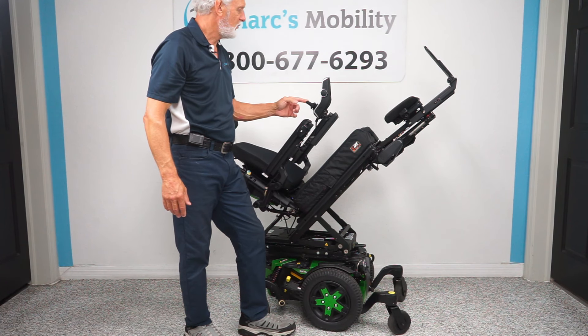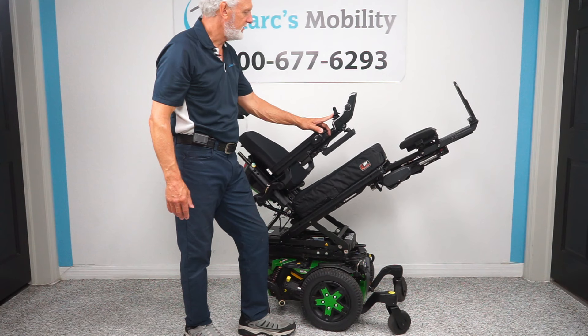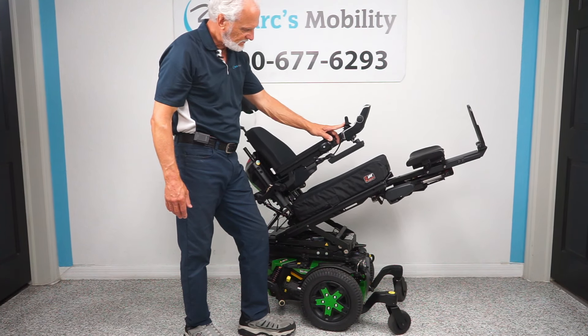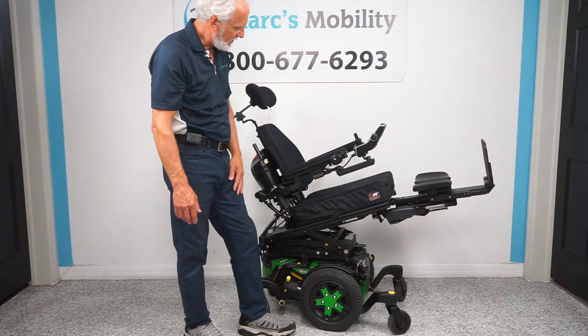I'm going to bring it back down so you can see even if we do it halfway tilted — even here, folks, your feet are still higher than your body.